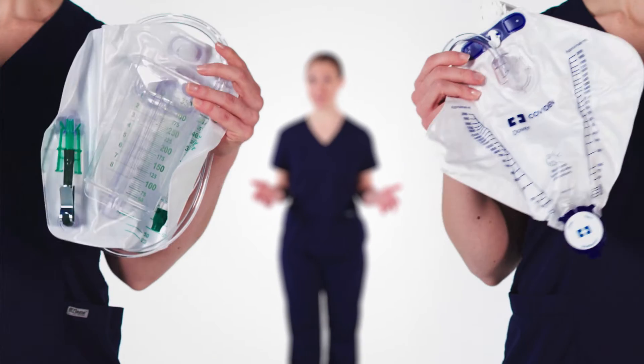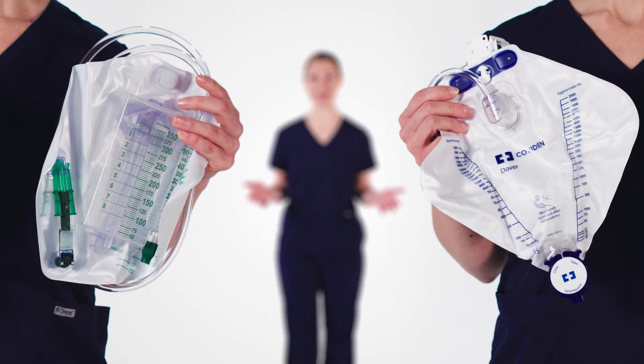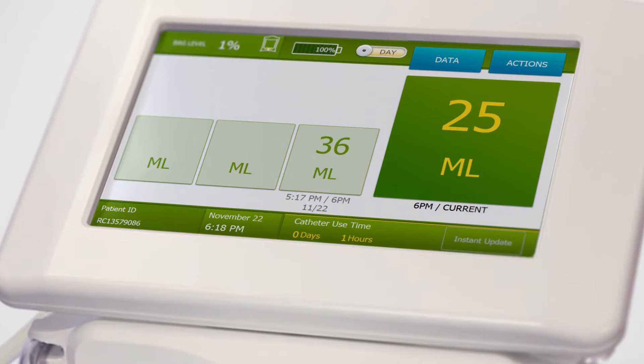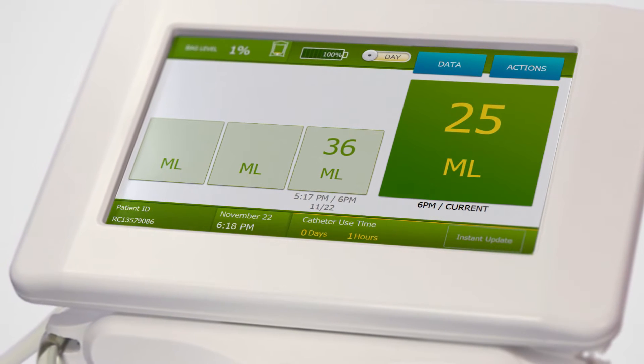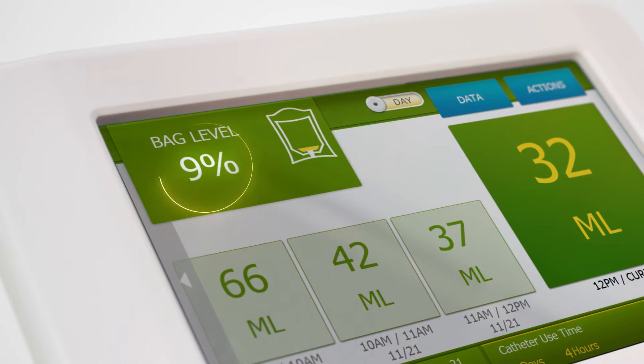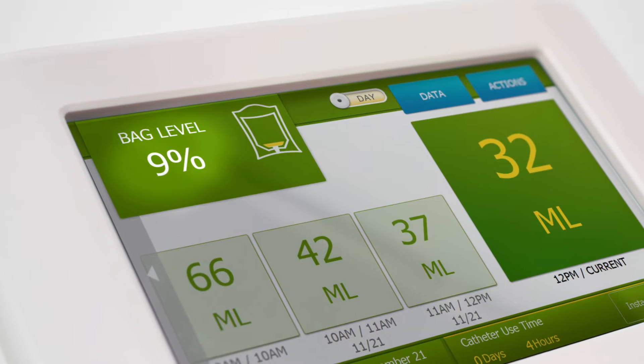Sensica UO works with any standard Foley collection bag, with or without a urine meter. The Sensica UO system measures volume by weight, which is highly accurate at small and large volumes.